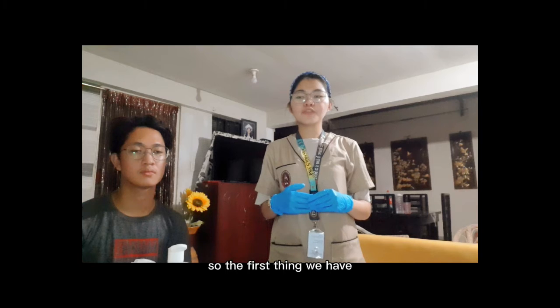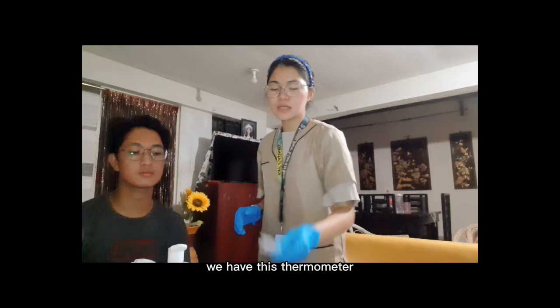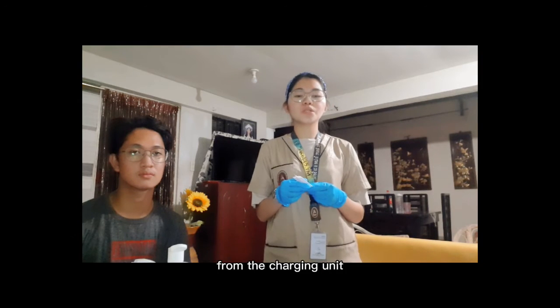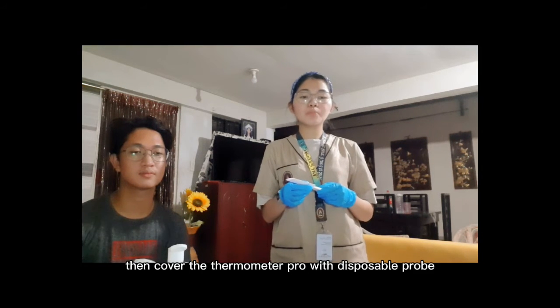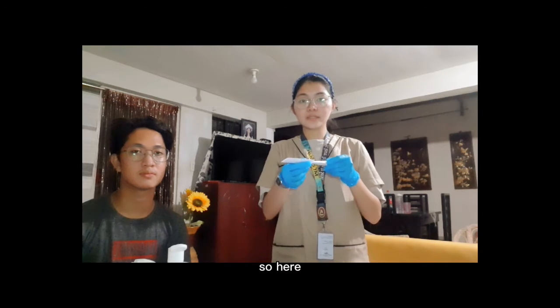So, the first thing we have to assess is the oral temperature. We have this thermometer, so we have to remove the electronic unit from the charging unit and remove the probe from within the recording unit. Then cover the thermometer probe with a disposable probe cover and slide it on until it snaps into place. So here.